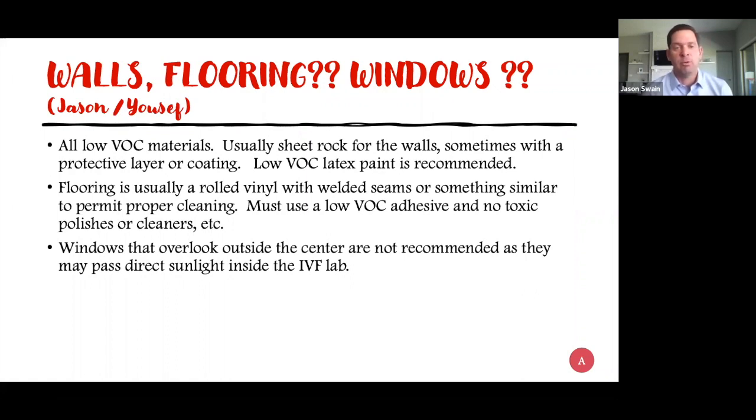Flooring is usually medical grade rolled vinyl with welded seams, so you don't have to worry about germs, bacteria, and things getting caught that you might have with tile or grout that may or may not be used, or carpet in other areas of the clinic.